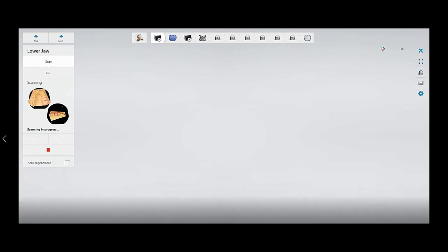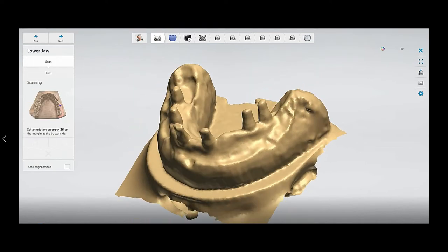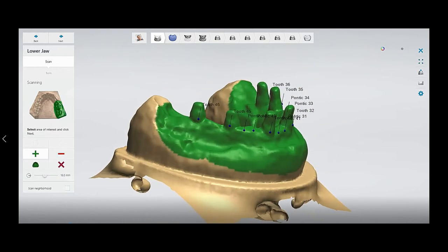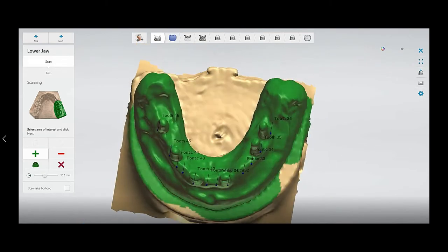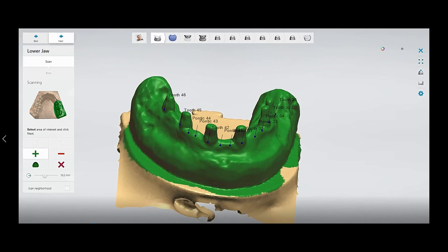After placing the models, just close the scanner and press Next — scanning will start. First it will prompt you to select the teeth and the pontics; mark them accordingly where you have pontics and where you have teeth. Then select the area that you want to be precisely scanned and mark it green. After that just press Next. You can select an area if you want and then press Next.